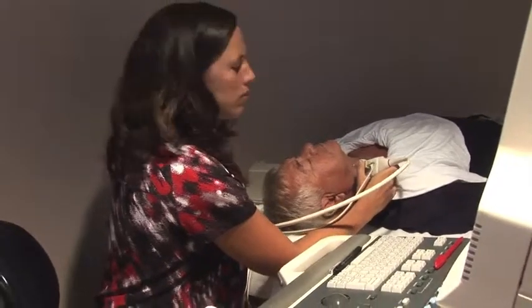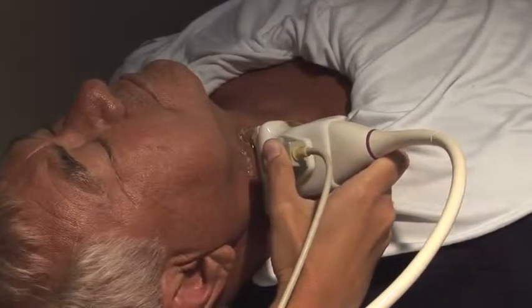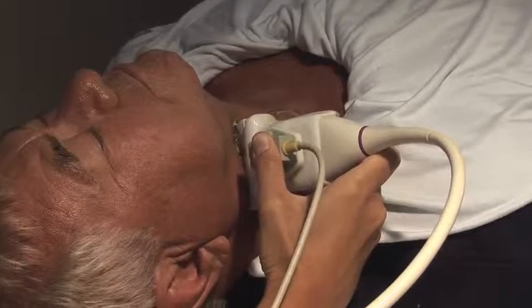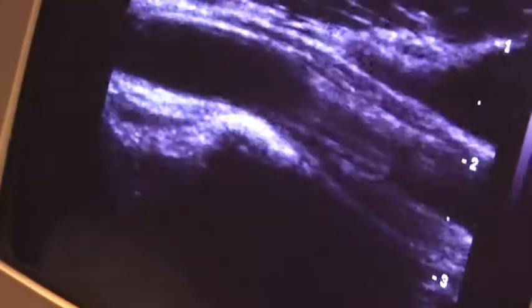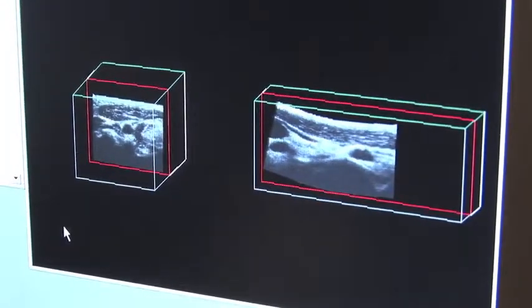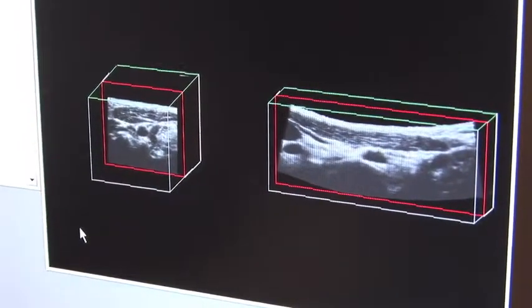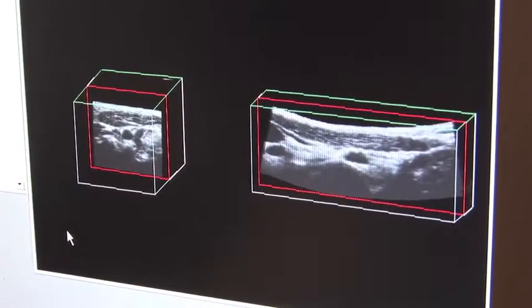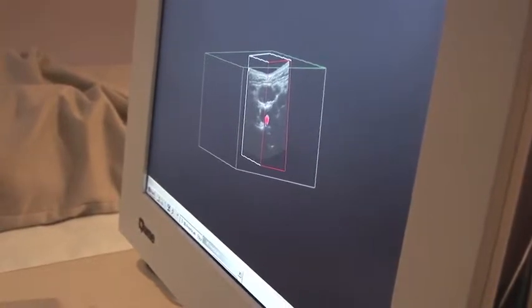But this study that's being published now adds another way of identifying high-risk people with asymptomatic carotid stenosis, and that's a 3D ultrasound examination of the carotid arteries, looking for ulcers, ulceration of the carotid plaques, or areas where some of the plaque has broken off and gone up into the brain. And in this study we found that patients that had 3 or more ulcers in the carotid arteries on either side had a risk that was equivalent to that of patients with microemboli. Our microemboli results were confirmed last year in a multi-center international study, but this is the first study to show that ulceration detected by 3D ultrasound identifies high-risk asymptomatic stenosis.